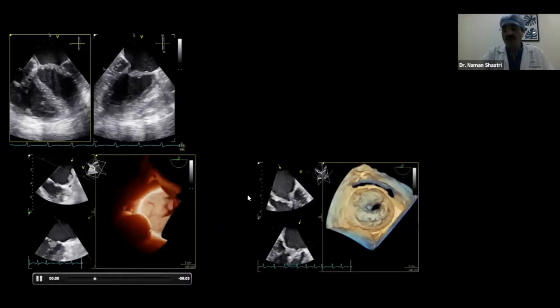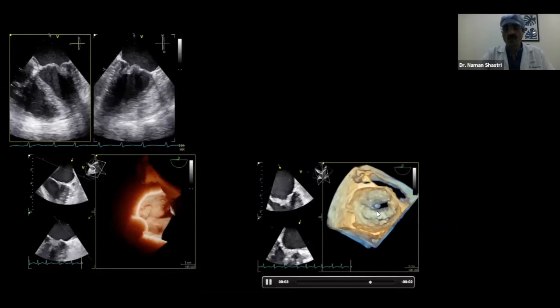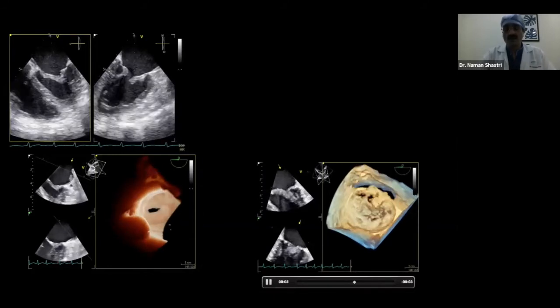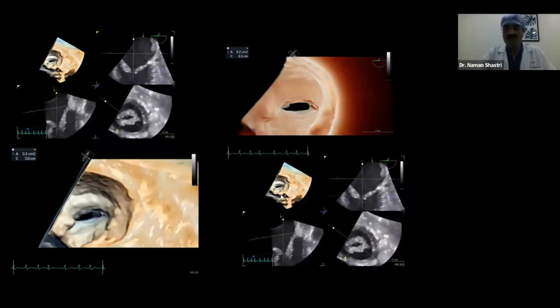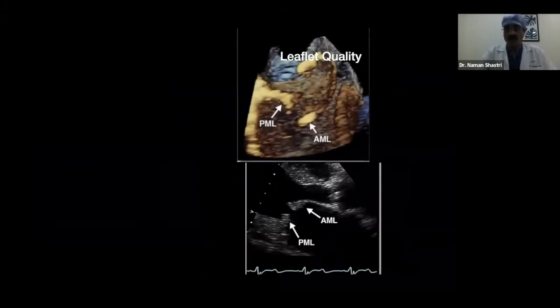Now, in this opening, you can see many significant calcification and fibrotic structures, but we want to measure exactly what is the level of stenotic part. So here again, with the same Praxis Slice or reconstruction software, we can make a very nice perfect plane at the level of mitral valve leaflet opening area, and we measure this planimetry area, and we can come to the right conclusion about what is the area of opening. So even for stenotic lesion, we can get a better idea about the stenosis.